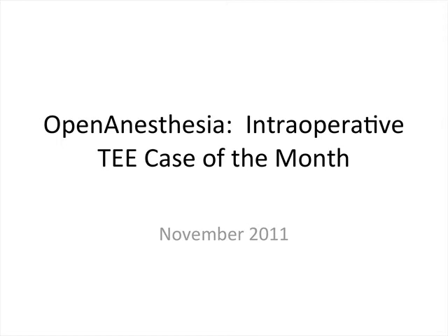This is Dr. Julie Huffmeyer with our Open Anesthesia intraoperative TEE case of the month for November 2011. Each month we feature an operative case which teaches or emphasizes an important aspect of basic intraoperative TEE.